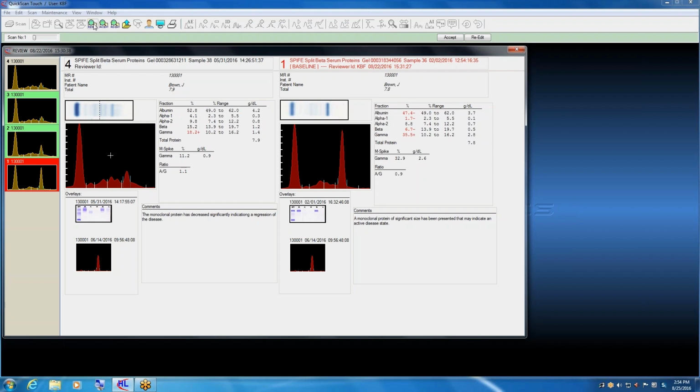Another option which will be available, if you have multiple pathologists reviewing, the pathologist could select that they only want to review patients that they have been reviewing and reporting on, or the pathologist can opt to look at all of them.